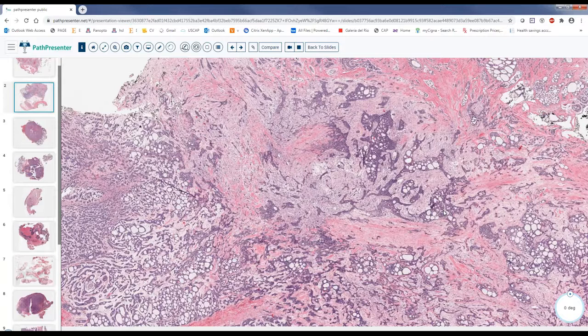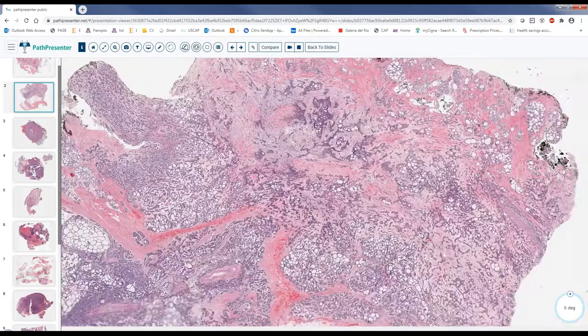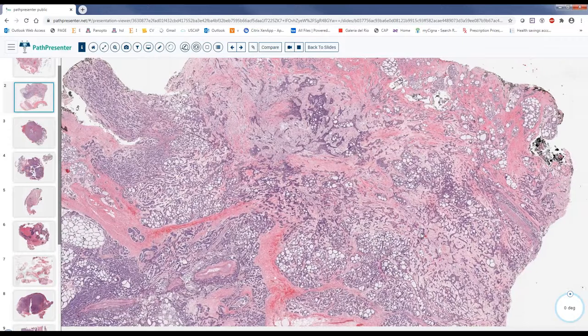Other parameters are necrosis, mitosis, and how the tumor looks, and you will see if it is very ugly. It is not like a grading system. It's not universal. You won't see everybody using it, like Nottingham for breast or Gleason scoring for prostate. Everybody is using it subjectively, but overall, comment on the solid area nonetheless.